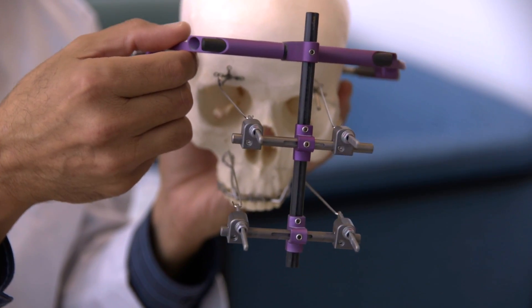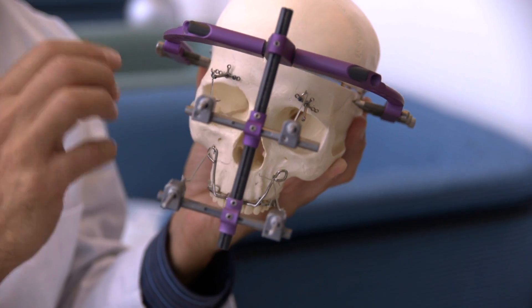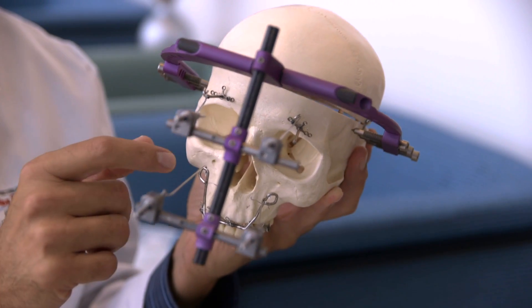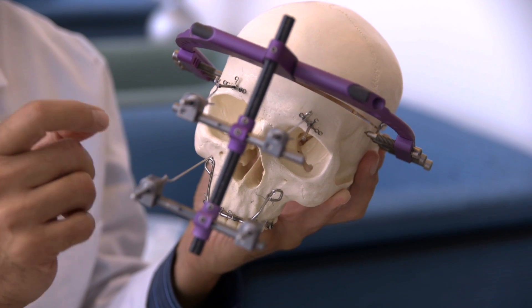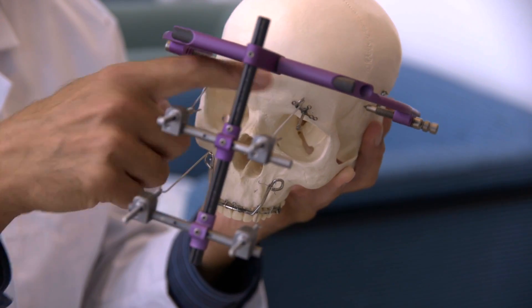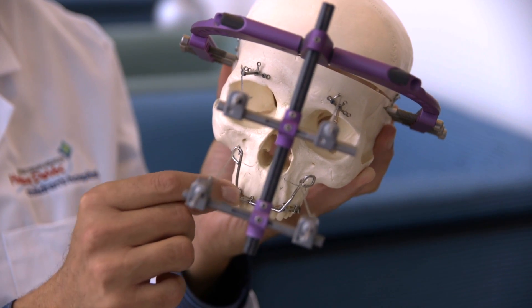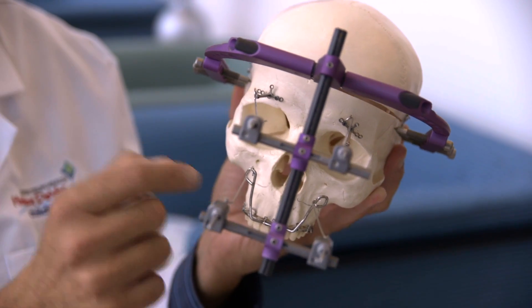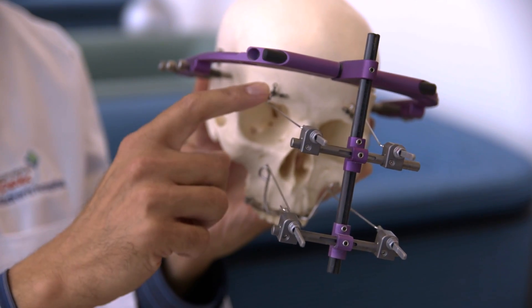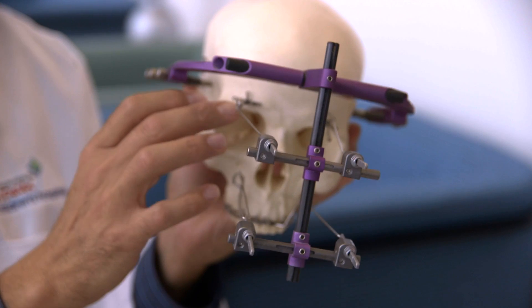Now we have a stable anchorage. We then go in through surgery and make our osteotomies, or bone cuts — depending on what the patient needs: upper face, lower face, or a combination. With the osteotomized bone, we apply a fixation device — pins that go into the bone and come out percutaneously through the skin. For the lower face, we have an orthodontic appliance like a retainer attached to the teeth. Little bars are attached to the appliance and come out around the lip so that we can connect them through wires from our bony anchorage points to the stable halo, where the jack screws allow us to move the facial bones.